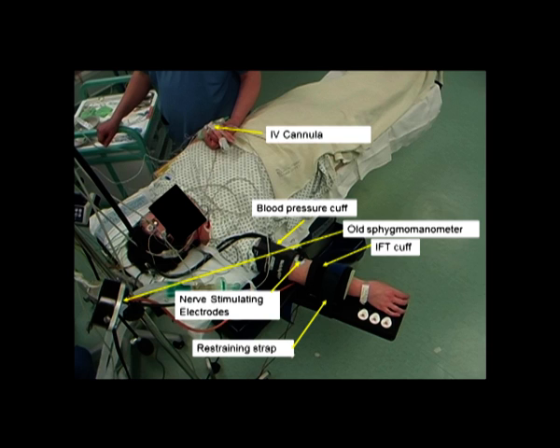A digital recorder with closed headphones in order to present to the patient the command to open and close the fingers of the isolated arm. You will need to have prepared the command with the name of the patient.